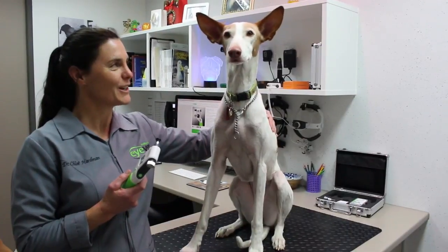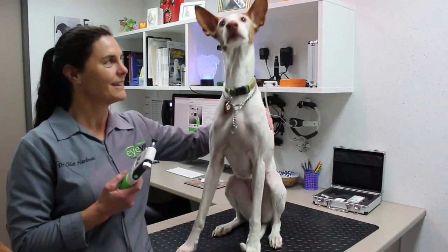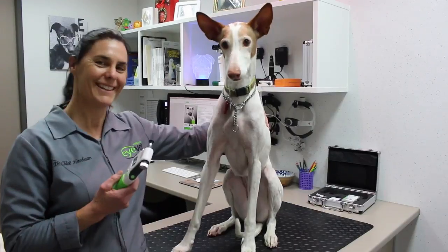Alice, do you like the new Eye Care Toner Vet Plus? Of course you do. Thanks for listening.